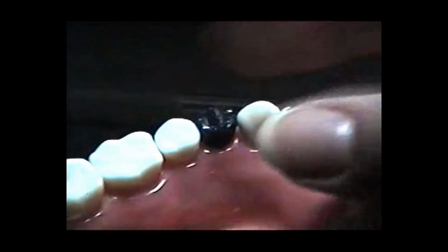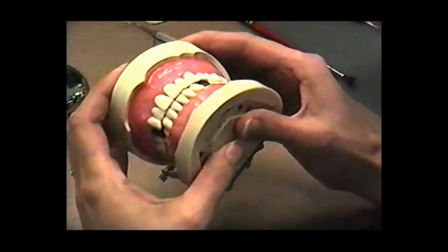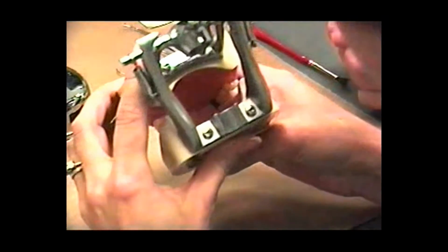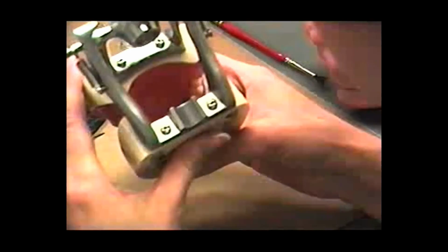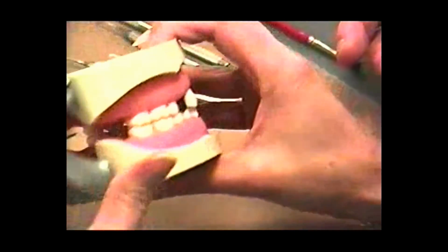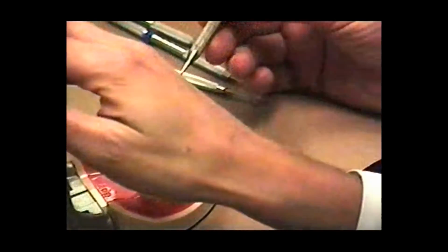Help me out here, Dr. Abbott. Where do we want our contacts on this tooth? We can figure it out. We probably want one on the buccal cusp tip. Mesial, on the distal incline? Buccal, yeah, distal incline of the buccal cusp against the distal fossa. So we want one on the distal incline of the buccal cusp, and we probably want one on the distal fossa from the upper. Distal fossa from the maxillary.